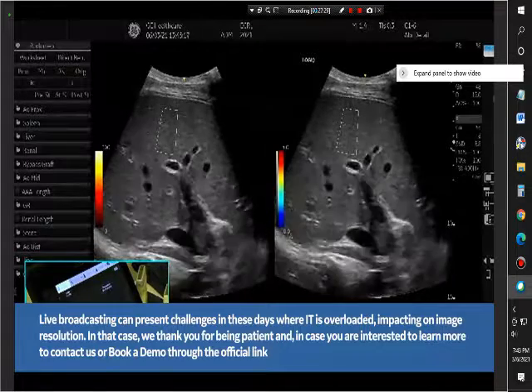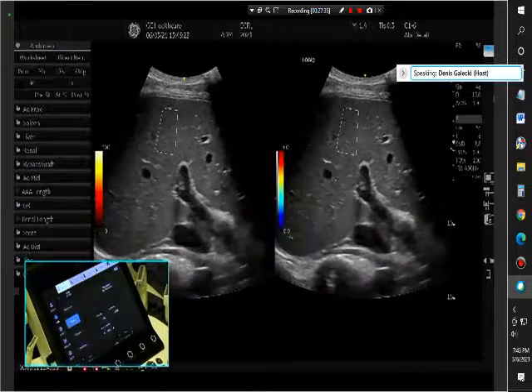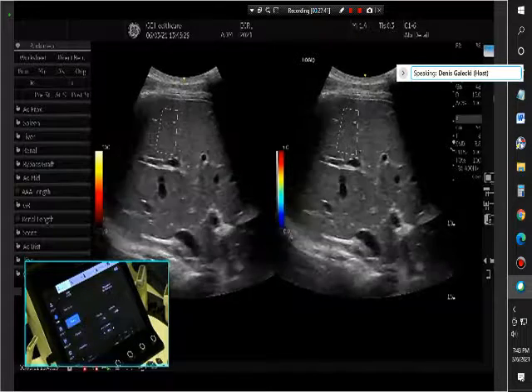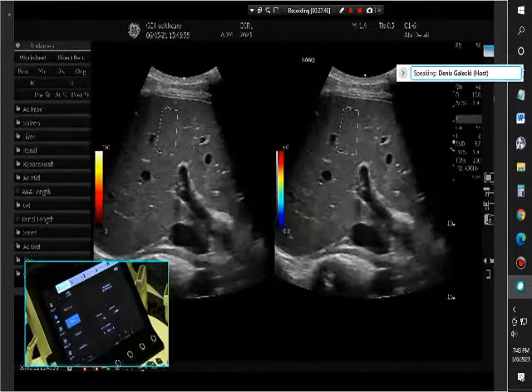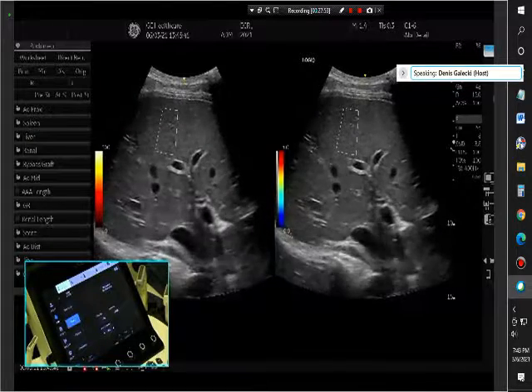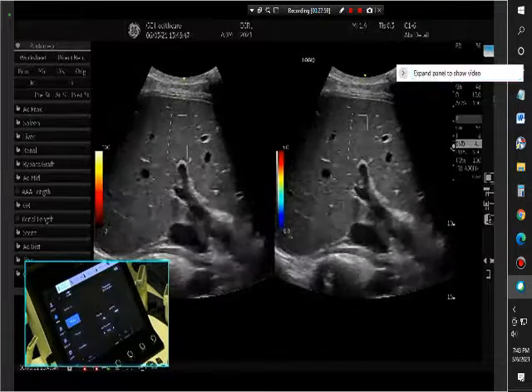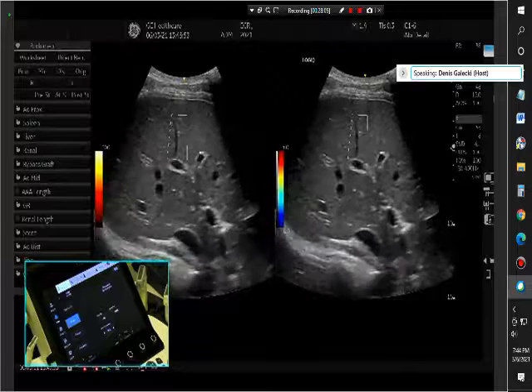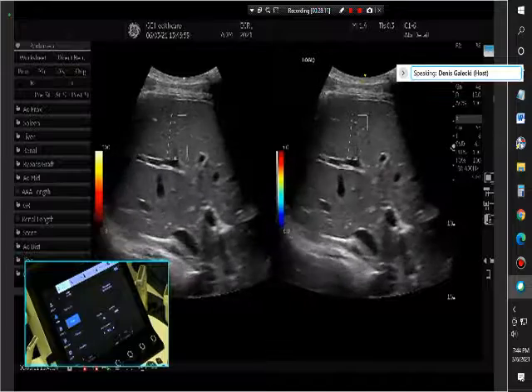Shear wave elastography. Let's go back to the presentation of Dr. Casinotto about shear wave and ultrasound guided attenuation parameter. As you know, 2D shear wave elastography is an advanced technique that provides quantitative as well as qualitative analysis of stiffness. In our case, liver tissue, to stage the liver fibrosis. After positioning the patient and the transducer, you can have on the left side the quality indicator, and at the same time on the right-hand side the elastogram itself.